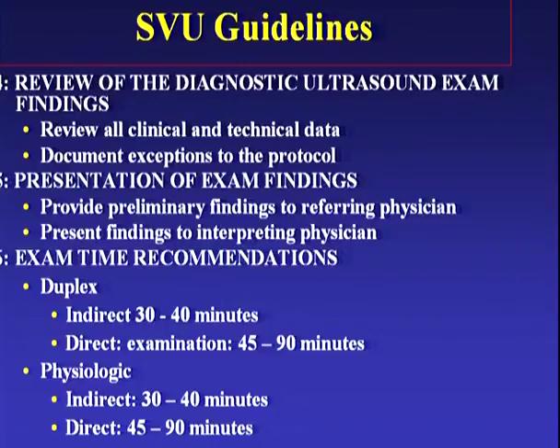This can be a pretty complicated examination, with the provocative movements that you may have to put the patient in to elicit the response of whatever problem they came into the lab. Physiological, same type of time frames, 30 to 40 minutes, and the direct assessment at 45 to 90 minutes.